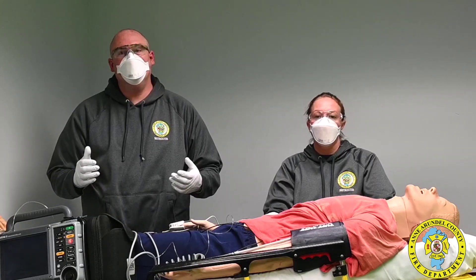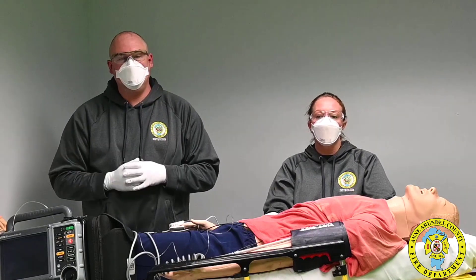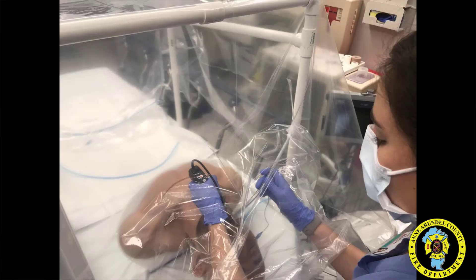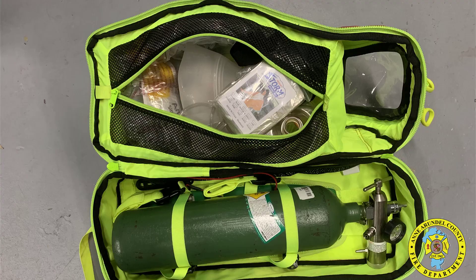By now you've probably seen or heard that hospitals have gotten creative in coming up with ways to minimize aerosolization during high-risk procedures like airway management. Some docs are even covering their patients with blankets and pieces of plastic, and some are using clear boxes to manage the patient's airway. Here in Anne Arundel County, we're going to place a poncho with every bag valve mask to minimize your exposure.